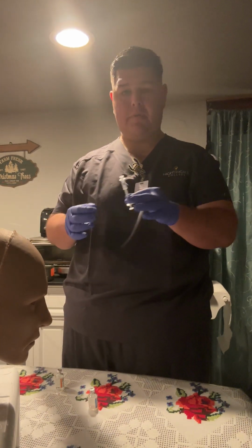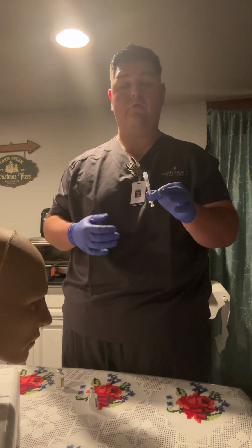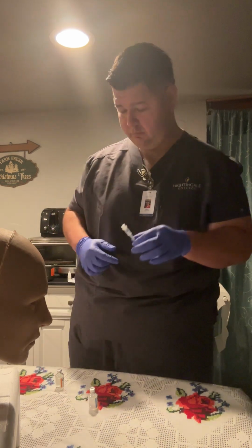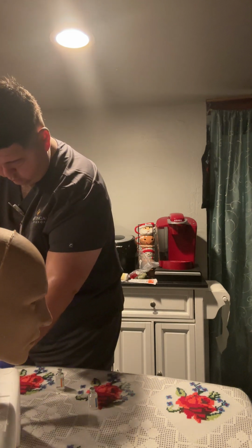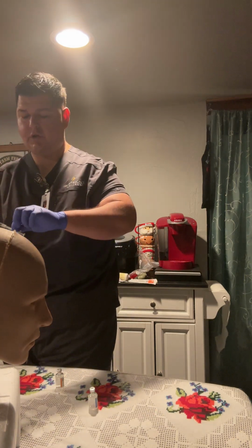Carefully, I will recap the needle using the swoop method, where I will pick up the cap using the needle. And this is to avoid getting poked.